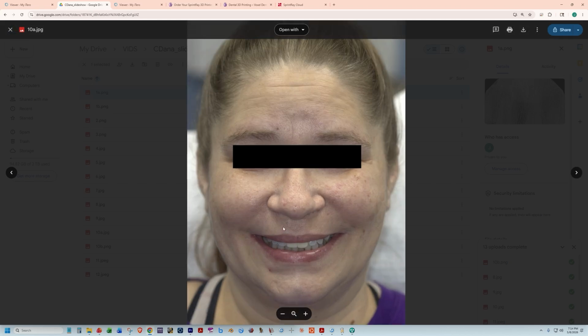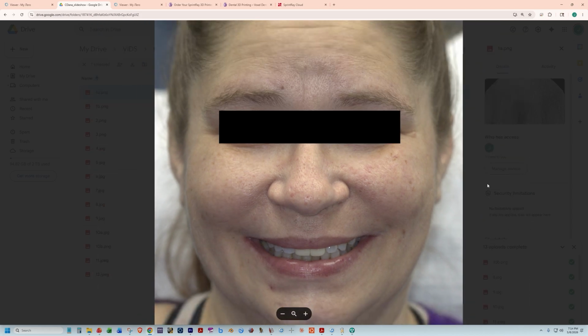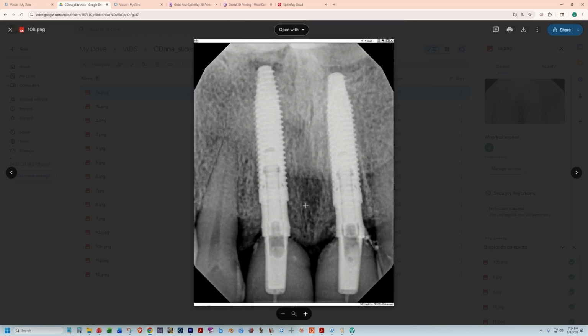We made sure very closely that these 2 teeth were not in occlusion for obvious reasons. We don't want her banging on these when she bites. And then we took a radiograph, so you can see the shape of these temp crowns. Goes to the platform of the abutment here, and hopefully the shape of these temp crowns over the next 4 months, hopefully that shape will nicely shape the tissue so that we can do these as FP1 in the end.